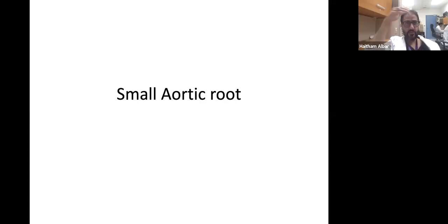Okay, what other prostheses can you use? TAVI? No, stentless. But that's going to be a major surgery for a patient of her age. And it's more difficult. Exactly. Stentless or Bentall, aortic root replacement, changing everything. That's more, but it's an option. It's true.